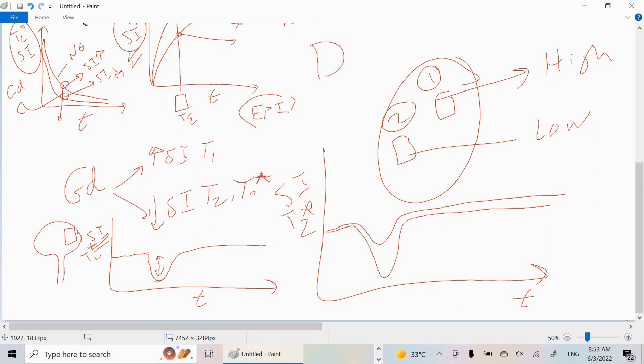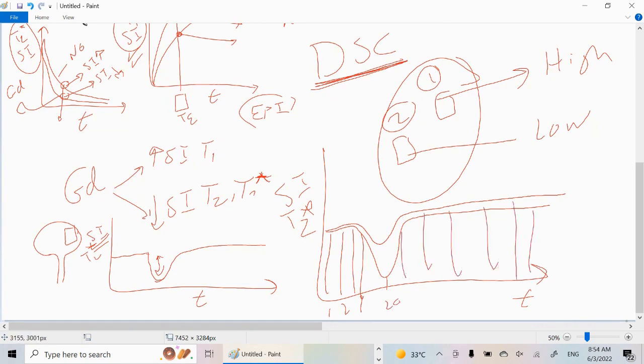So, dynamic susceptibility contrast, DSC, means that I take a series of rapid images. Here we have image 1, image 2, image 3, image 4, and so on, reaching up to about 20 images. Imagine the same voxel. Then, you create a trace for the voxel on all these images, and it draws this curve for you. From this, you derive some functions like the time to peak, which means the time from the beginning until it reaches the peak.